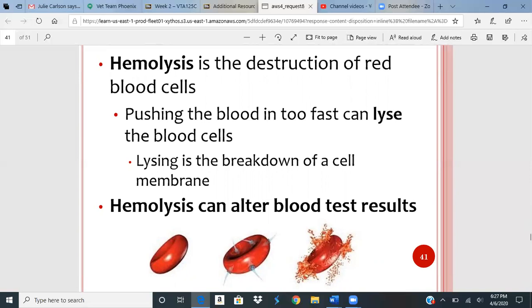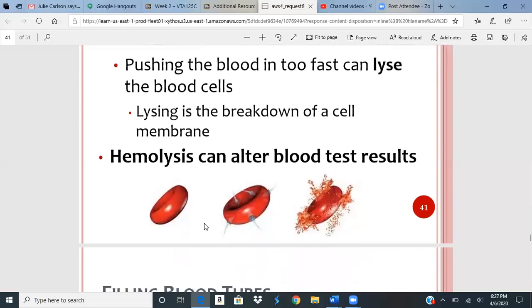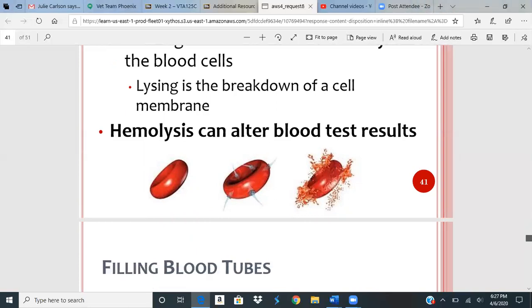So here's a good picture for you to kind of show you what's going on here. Here's your red blood cell. Here's lysing. So that means now we put holes in that red blood cell. Let's say we push down so hard on that syringe trying to get it in the tube. Now it's just broken apart. What's going to happen then is when you spin down your serum separator, you're going to get what looks like a red serum, as opposed to serum is supposed to be a straw color. When you've lysed the cells like that, it turns the serum red, and that can actually alter your test results.